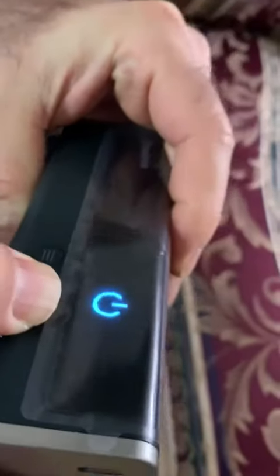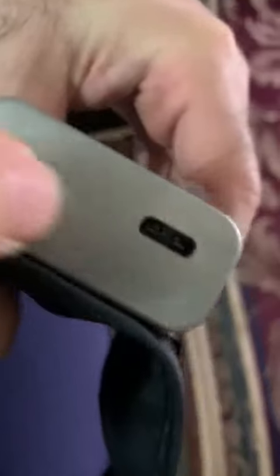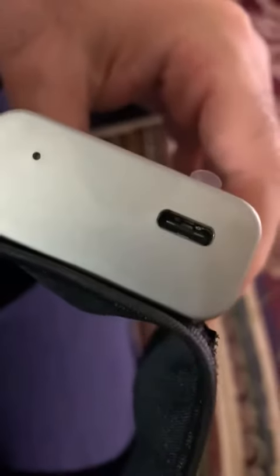It's very slim and very nice. The most important thing — it's actually rechargeable. Let's turn it off first by pressing for a few seconds. This is the USB-C port here, and this is how you would charge it.